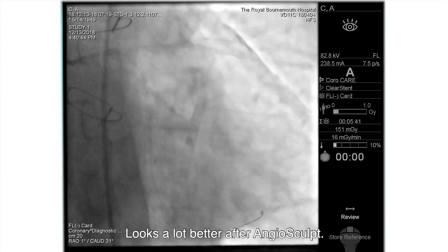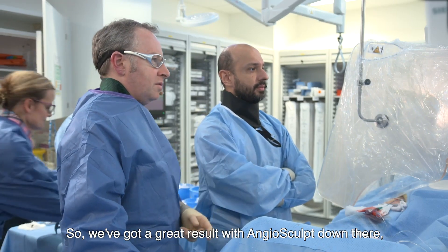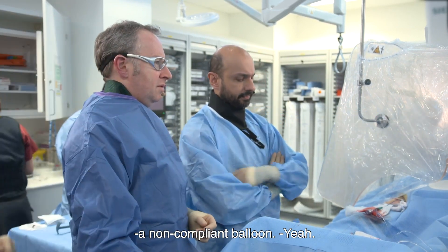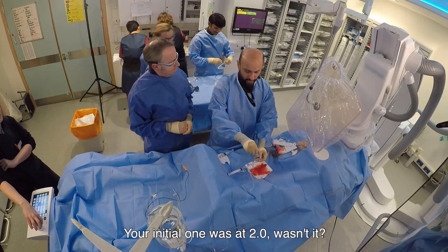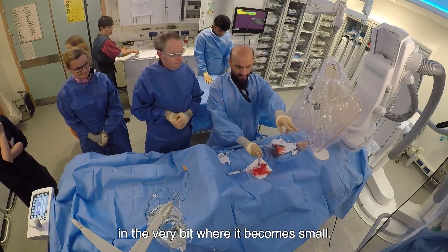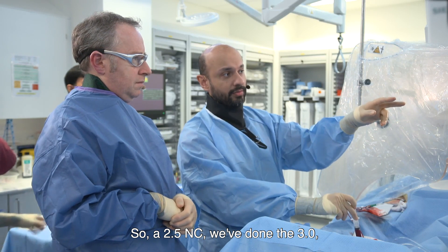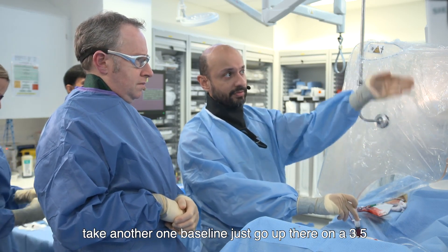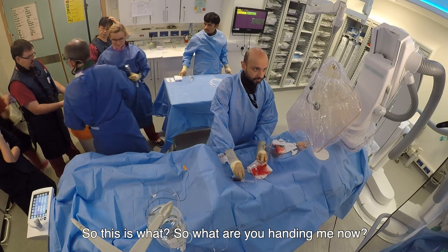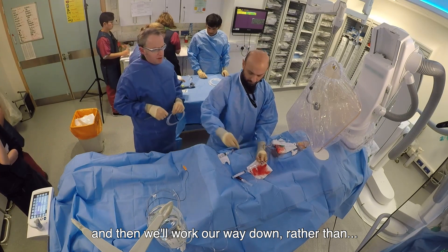It looks a lot better after angiosculpt. It'd be nice to take a picture and show the angiographic appearance. We've got a great result with angiosculpt down there - it's still not quite right there, a little bit of tissue. I think we should take a non-compliant balloon. Do you think we can go as big as 3.5 or 3.25? Your initial one was a 2.0 - about a 2.5 NC in the very bit where it becomes small. So 2.5 NC, we've done the 3.0. Let's take another one post-angiosculpt and then a 3.5 for the main vessel. This is a 3.5. We'll start with the 3.5 and work our way down.